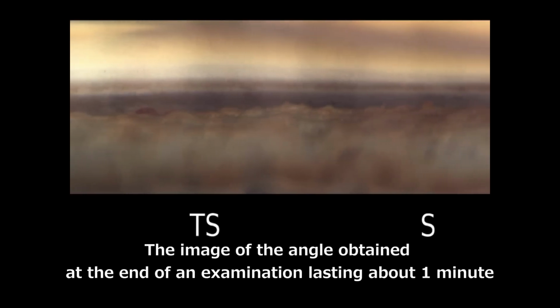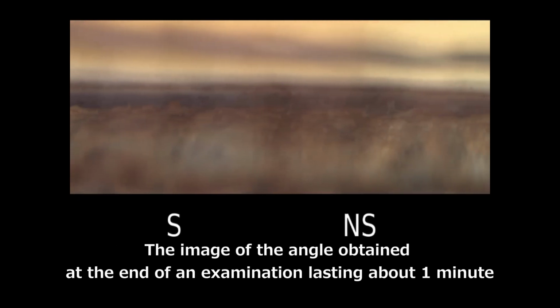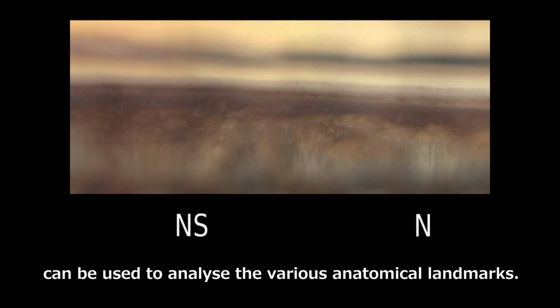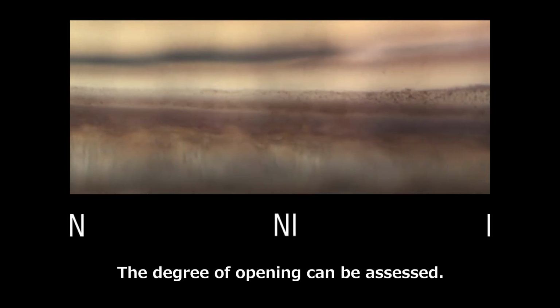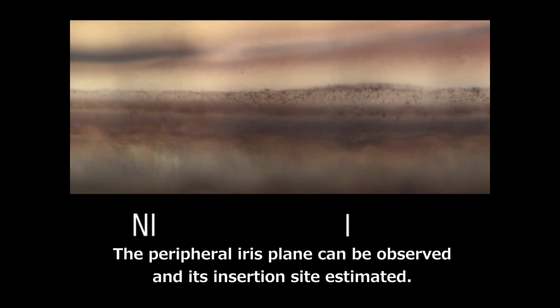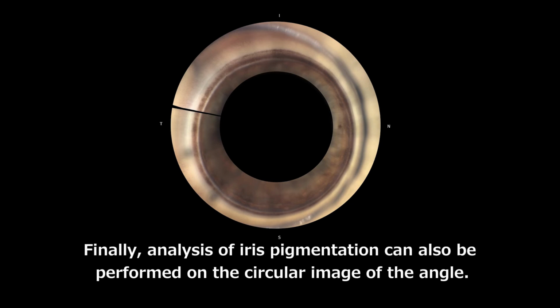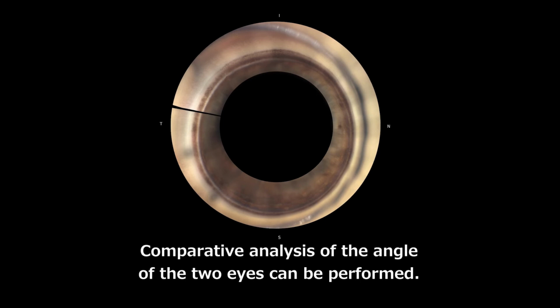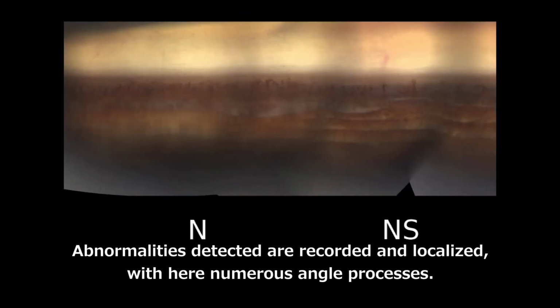The image of the angle obtained at the end of an examination lasting about 1 minute can be used to analyze the various anatomical landmarks. The degree of opening can be assessed, the peripheral iris plane can be observed, and its insertion site estimated. Finally, analysis of iris pigmentation can also be performed on the circular image of the angle. Comparative analysis of the angle of the two eyes can be performed.